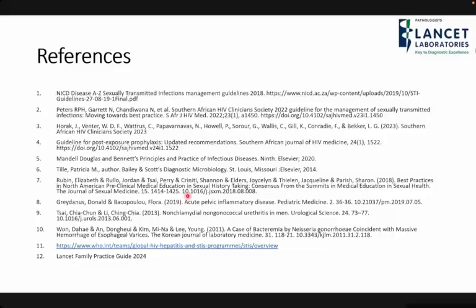quarterly or monthly, and you do quality assessment, you do internal controls, and you do quality assurance. But these point of care tests, they give you a batch of tests, and then you use those tests without continuously checking whether they are still working or not. So a batch can, but one test is not the same as the other tests.